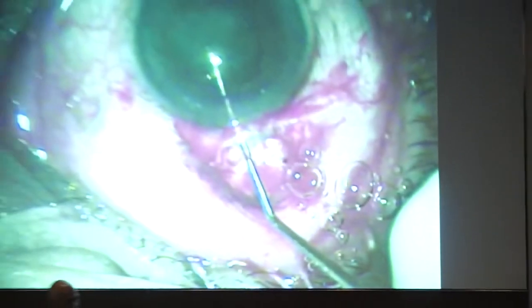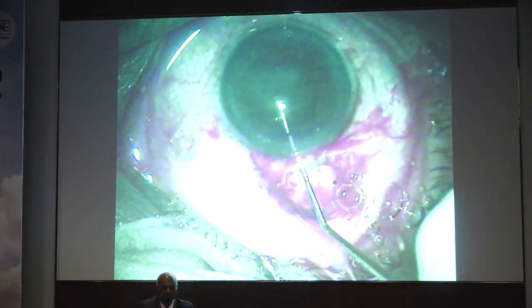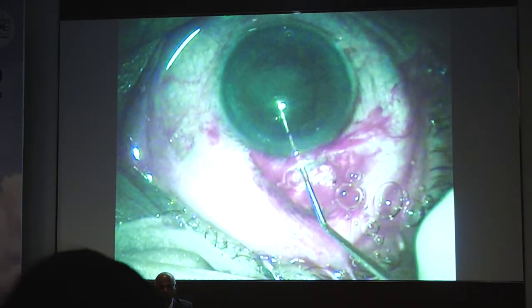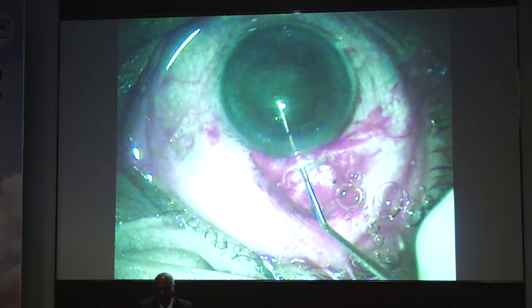Well, thanks to sir and ma'am, we run this course for almost the last 10 years and always there are enthusiastic takers. It's heartening to see manual SICS halls are always full and there is so much that manual SICS can do. Today I have been given a brief to speak about the various techniques of small incision cataract surgery. I'll be just running you through the 10 techniques that are the most common ones that are possible.